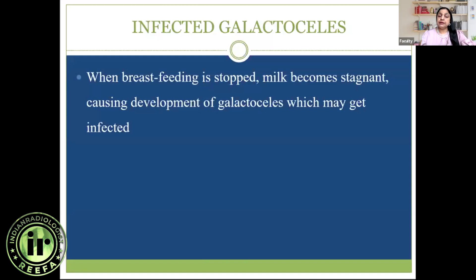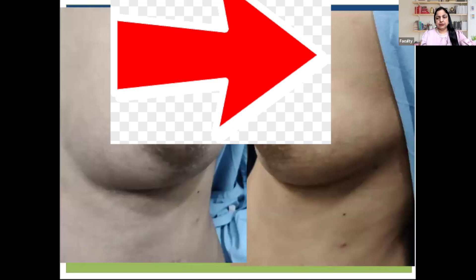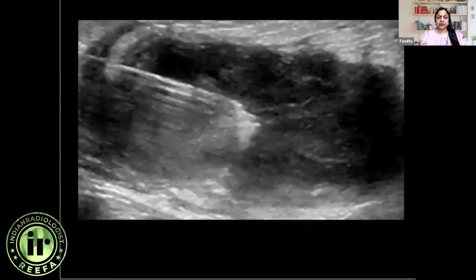Moving to infected galactocele — when breastfeeding is stopped, milk becomes stagnant and the patient can develop an infected galactocele after the formation of a normal galactocele. Once infected, galactoceles behave similarly to abscesses. A young lactating mother presented with a swollen nipple-areola complex just after weaning. Mammogram showed an oval circumscribed equal-density retroareolar mass, and ultrasound revealed a thick-walled circumscribed heteroechoic collection. An infected galactocele was diagnosed and aspirated with an 18-gauge needle, and the patient was put on antibiotics.